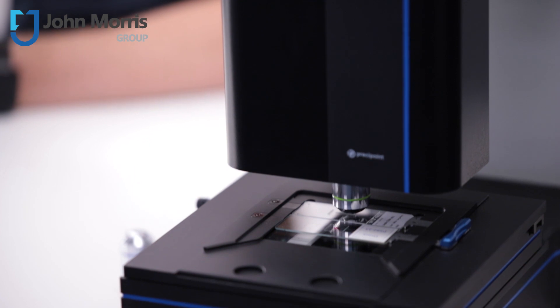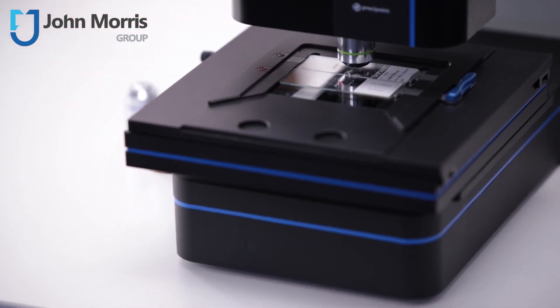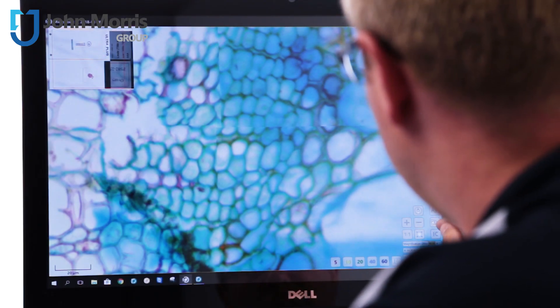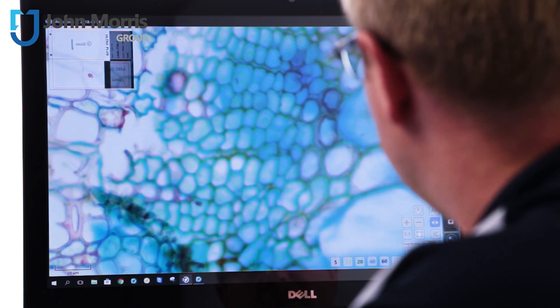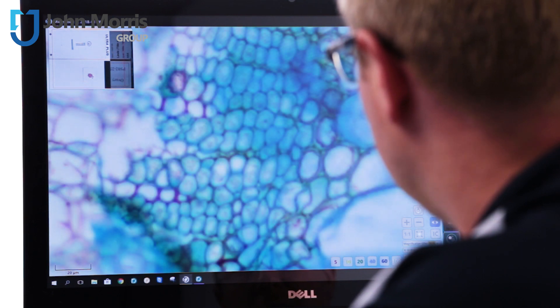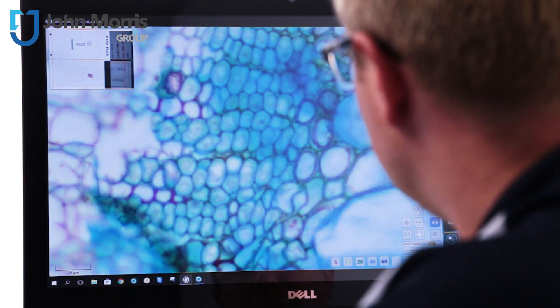Although the M8 has a brilliant autofocus it also offers the opportunity to do manual focus so that you can have a look at different layers on a slide and this is really ideal for histology samples. The way that works is if we find an area that we're interested in, instead of relying on the autofocus mode we're going to go into the manual focus and this allows us to have fine adjustments here and if things were at different layers that would help us to focus on the different layers that are actually within the sample.